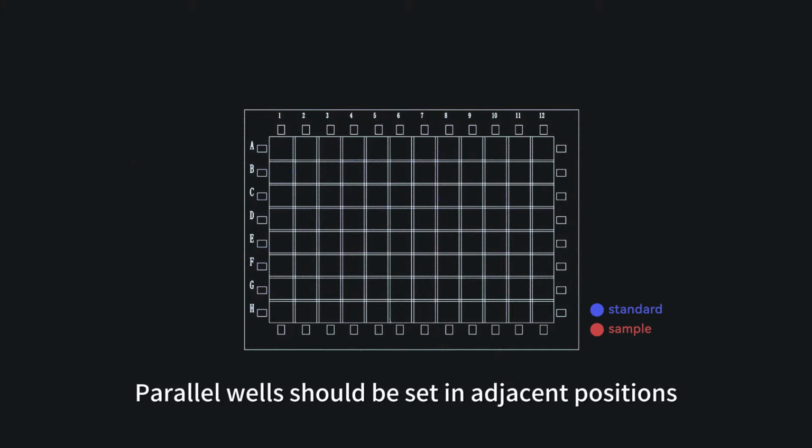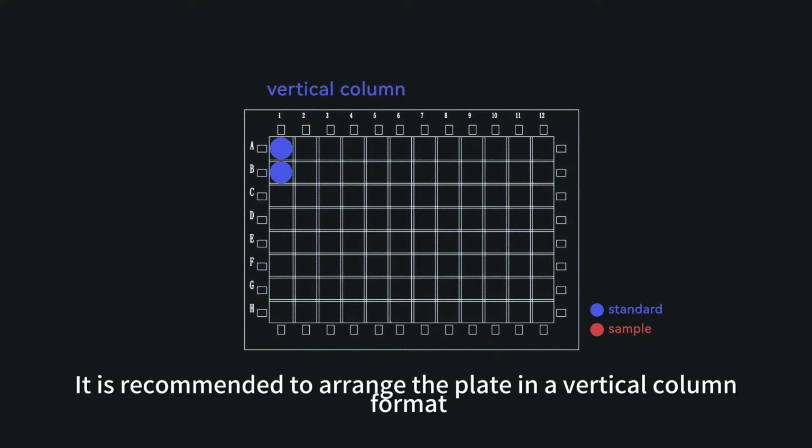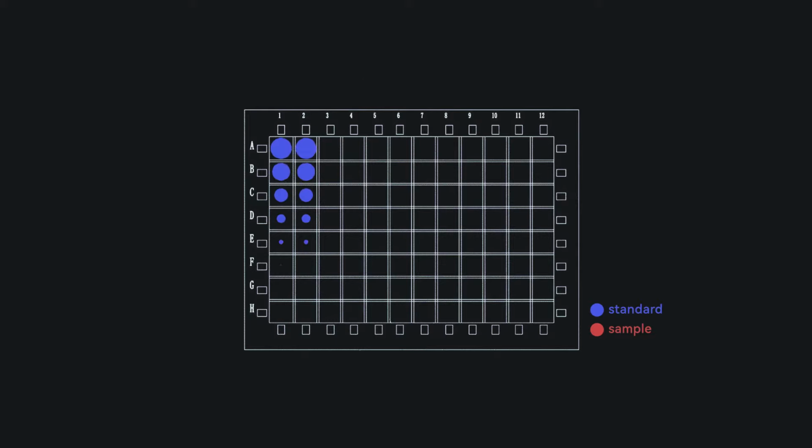Parallel wells should be set in adjacent positions, either in rows or columns. It is recommended to arrange the plate in a vertical column format. The following is a demonstration of arranging them in a horizontal row.